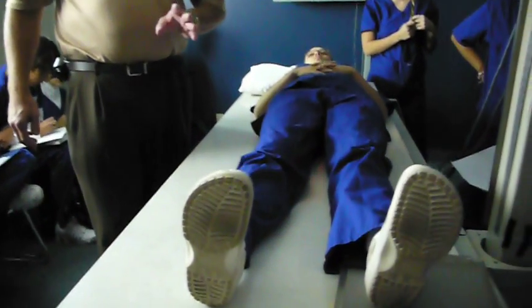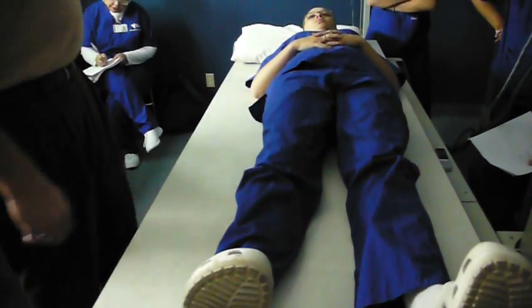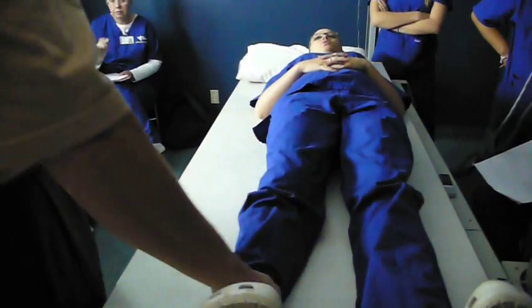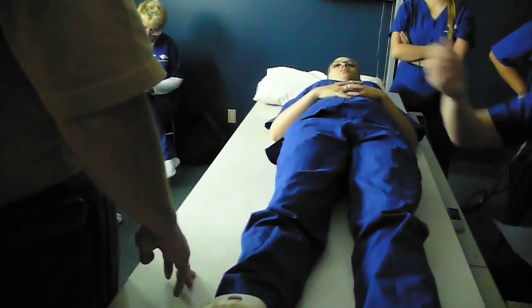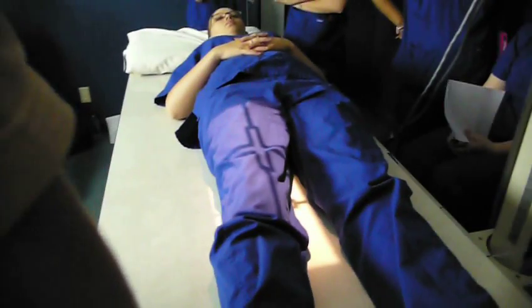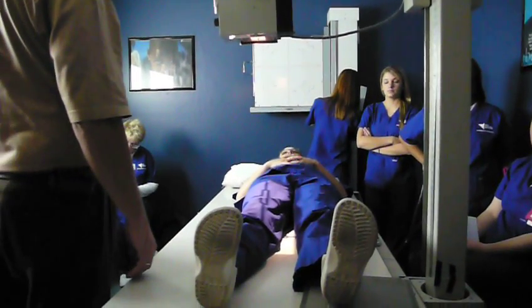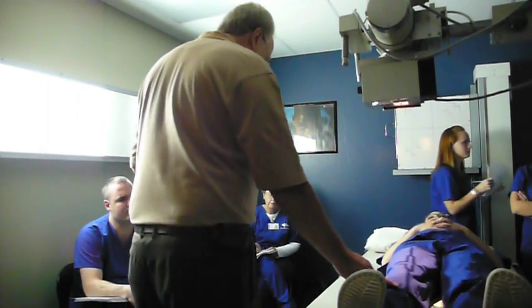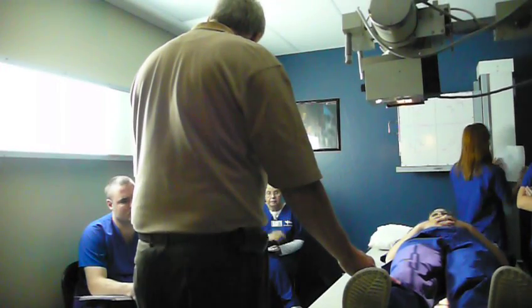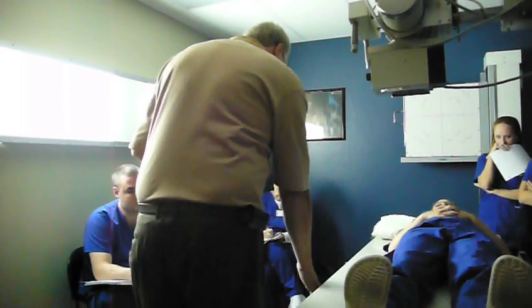I need to make sure I get soft tissue. There's my AP of the distal femur. I have her epicondyles parallel with each other — it's like I would do it for an AP knee. I have my IR an inch and a half below, with the bottom of the IR an inch and a half to two inches below the knee. I just line it up in a simple array.